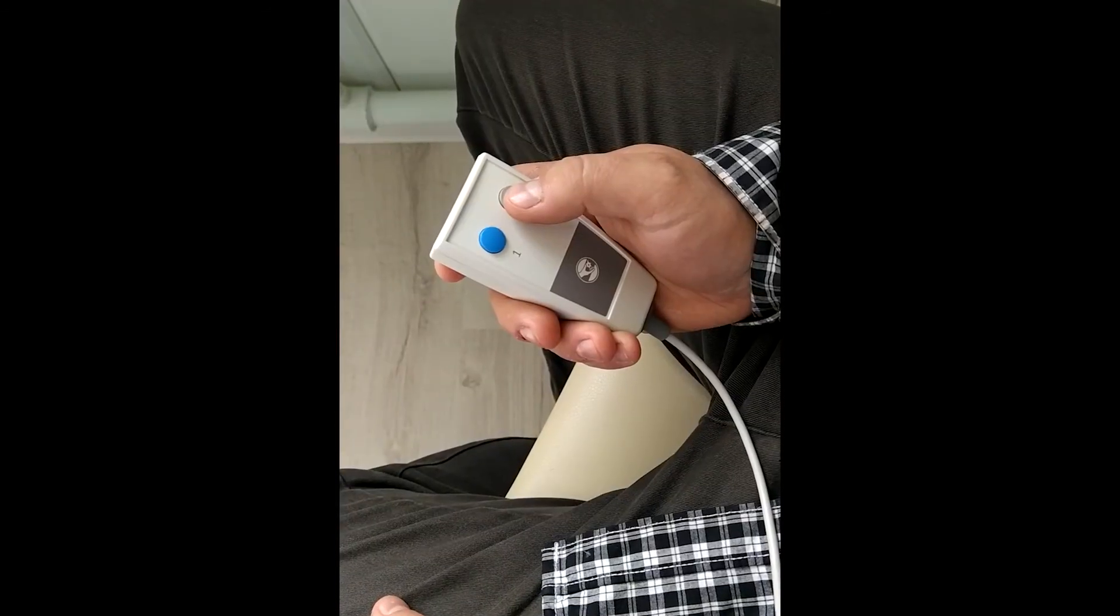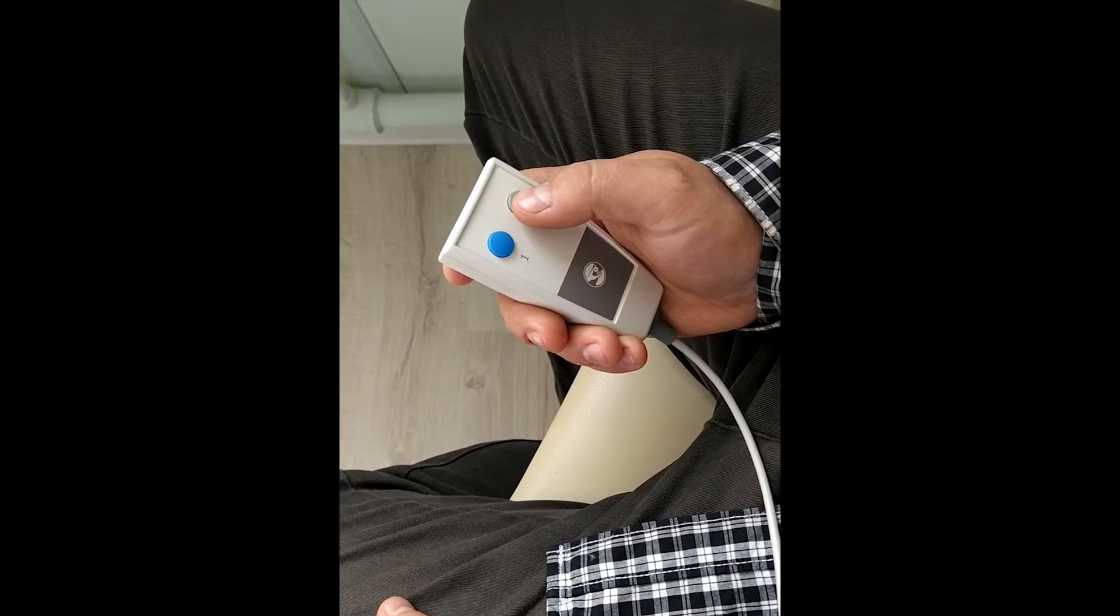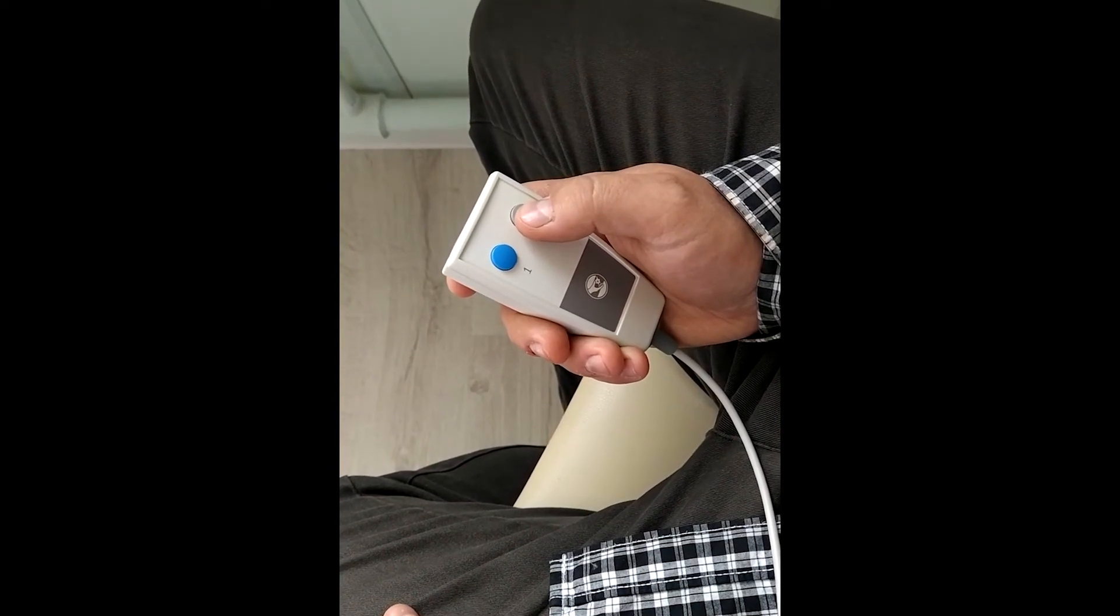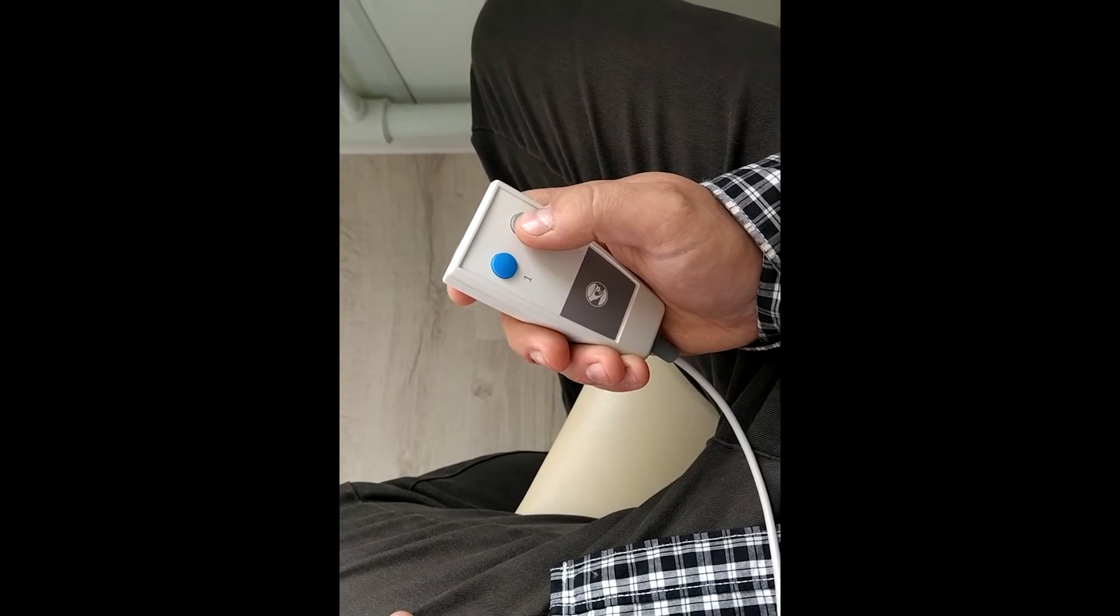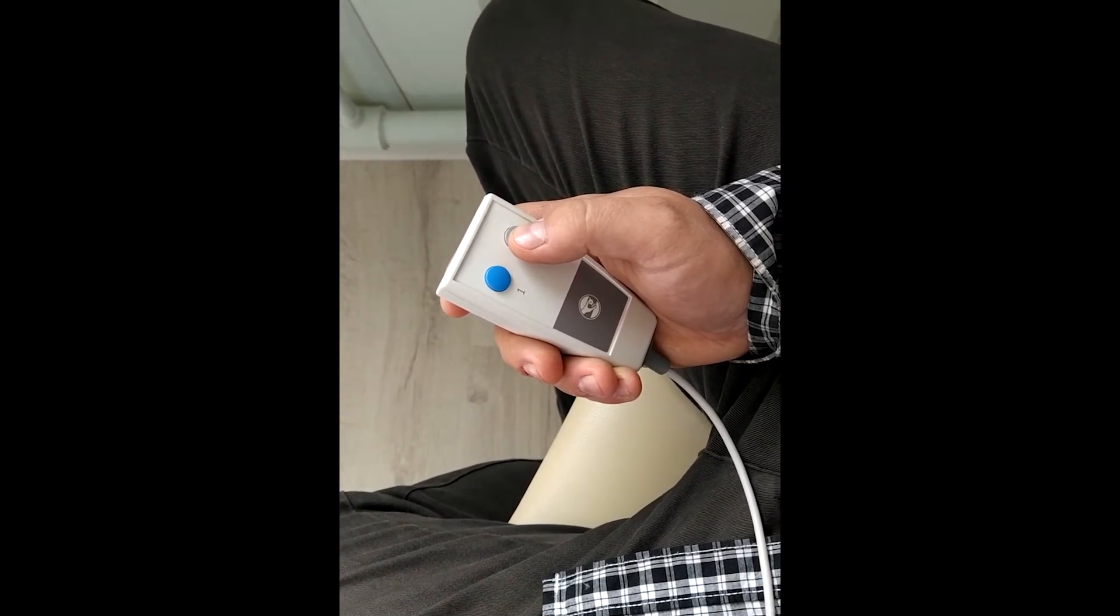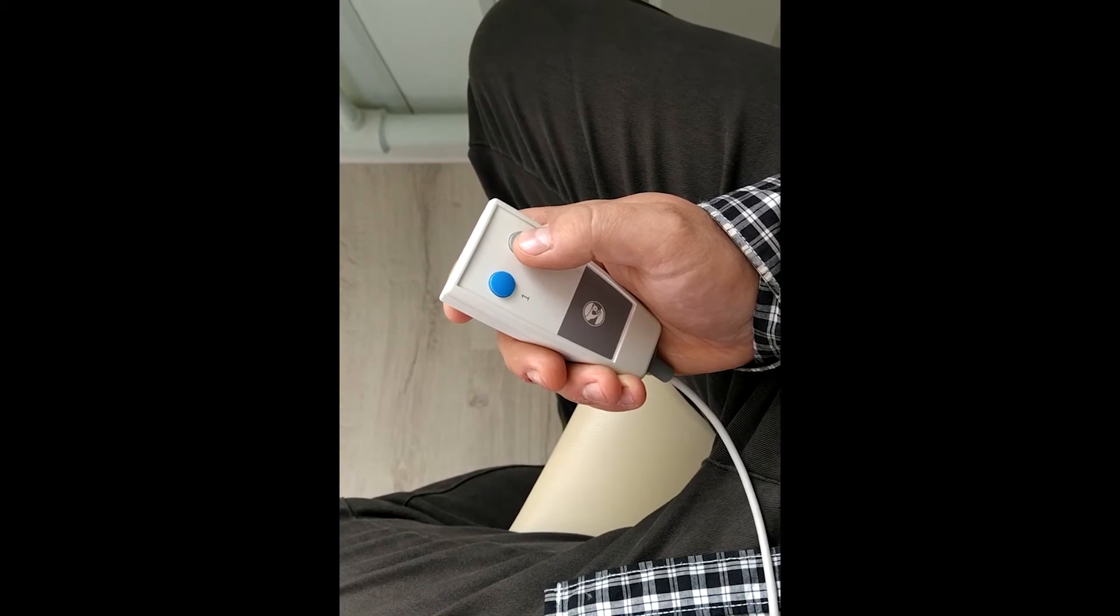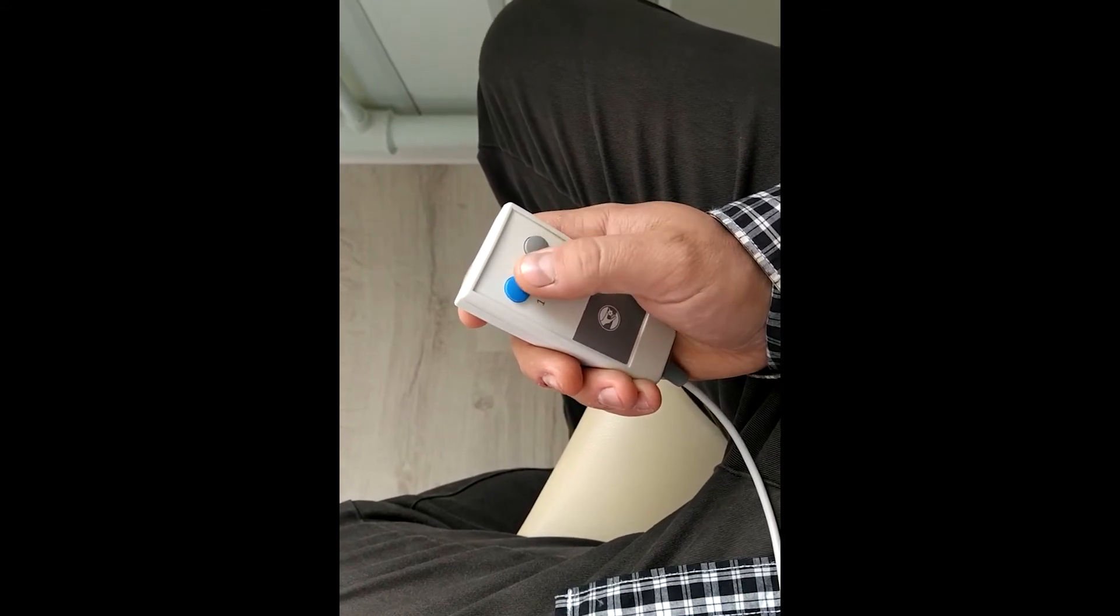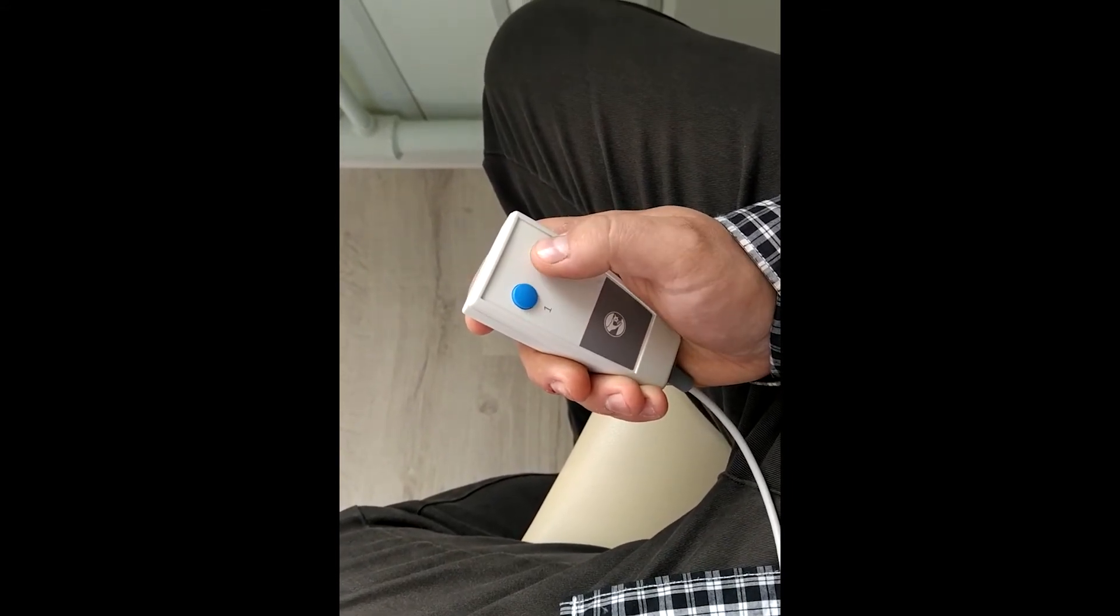We have instructed our patient to push the button when he will hear the target stimuli. In our case, it is a higher tone. The patient can push any button on this device.